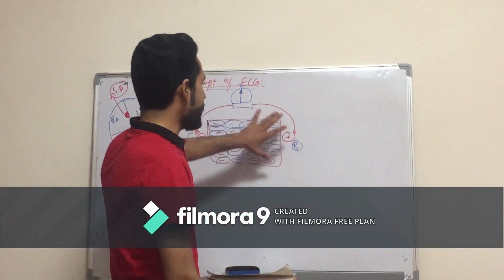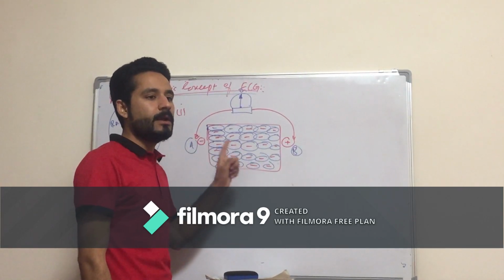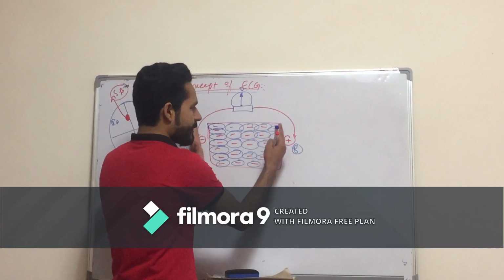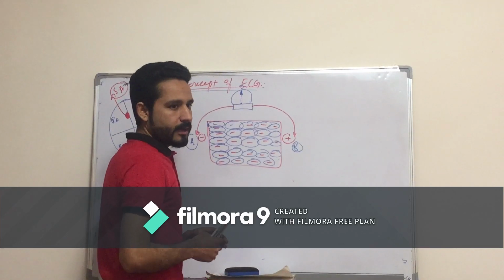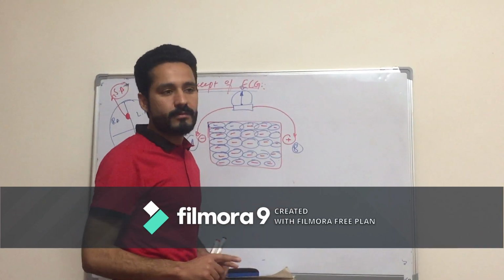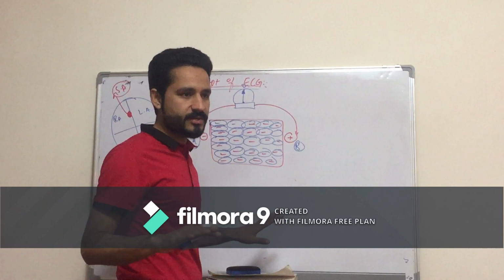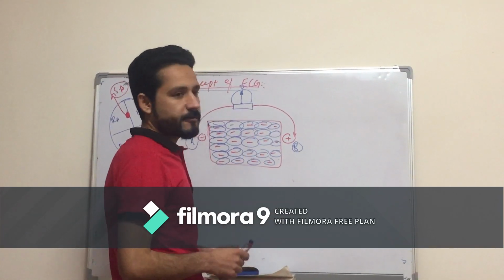In the relaxed condition there are only negative ions, so it is impossible to produce electrical impulses or current. When such myocardial cells are connected with a galvanometer, there will be no deflection, because there is no charge to be detected by the galvanometer. Now this is our first observation.